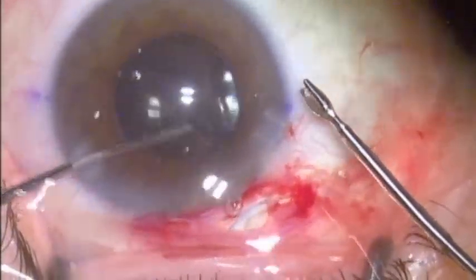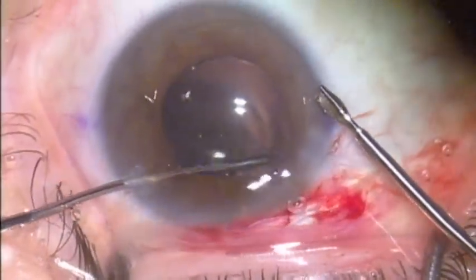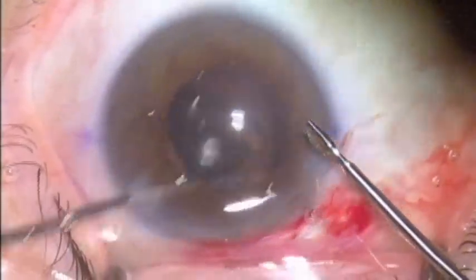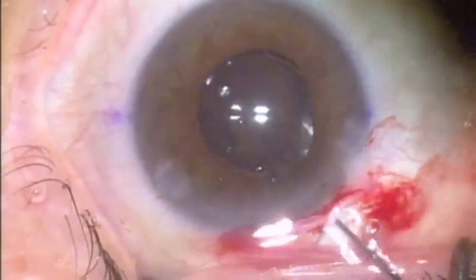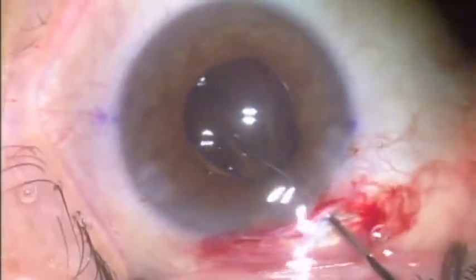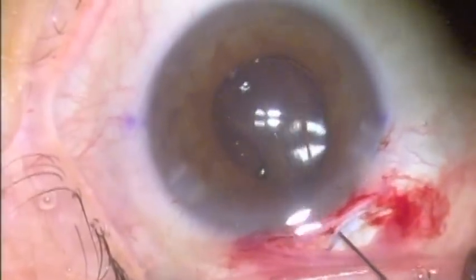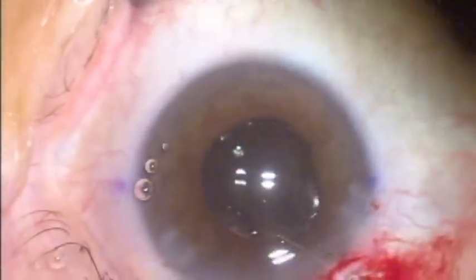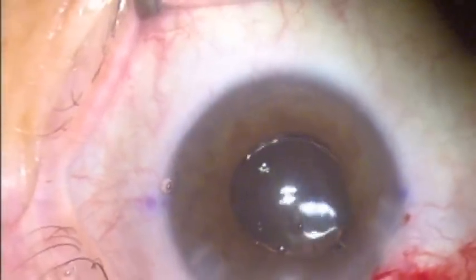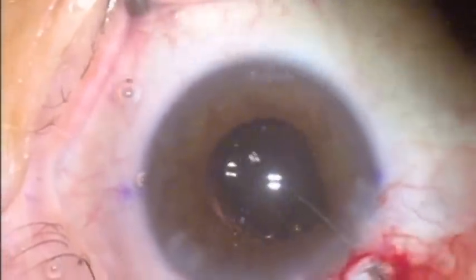Here I've guided it into position. After dropping this distal plate in the capsular bag, I'm going to inspect with a micro Kruglin hook to make sure that the plate is indeed in the capsular bag under the anterior capsule. I'll rotate the lens a little to make sure it's in the equator of the bag. Then by retracting the iris, I can grab the anterior capsule rim with the Kruglin hook to confirm it is riding over the plate, guaranteeing that the plate is in the capsular bag.